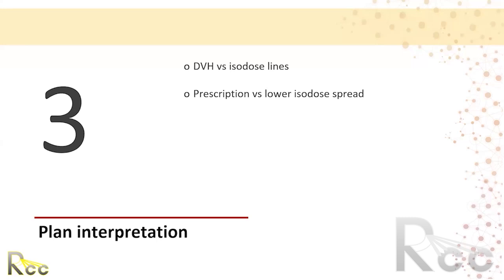And the DVH, at the last, we are checking how much dose, like the V20, V30, according to the criteria, how we are getting, and how much the PTV is getting as prescribed. I want to ask you, Abed, all these things that you mentioned, that the 95% isodose is going to 95% volume, the maximum dose, all this you can get from the DVH. So why bother with the plan itself?